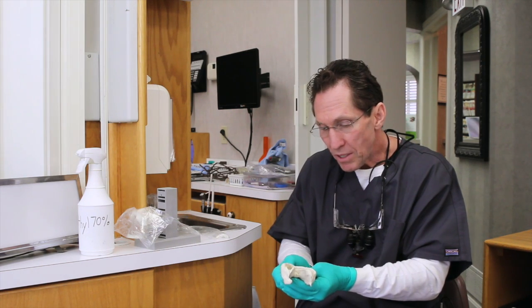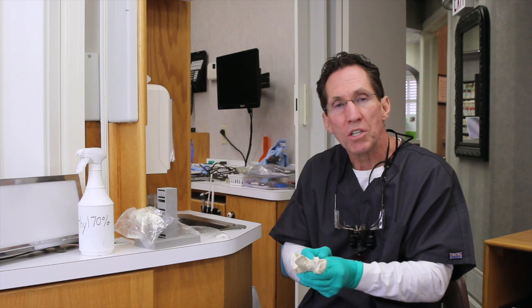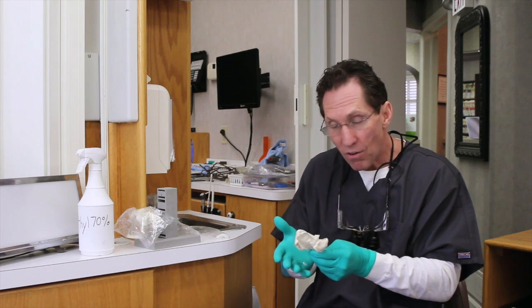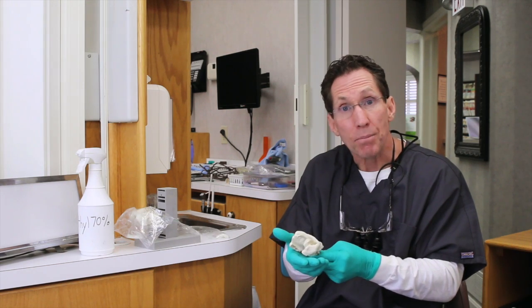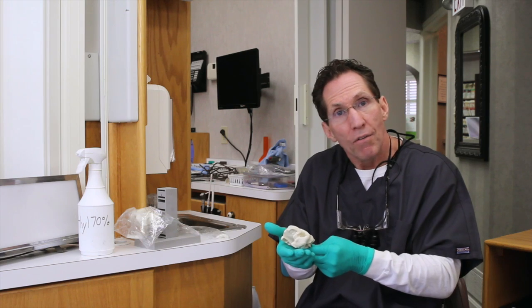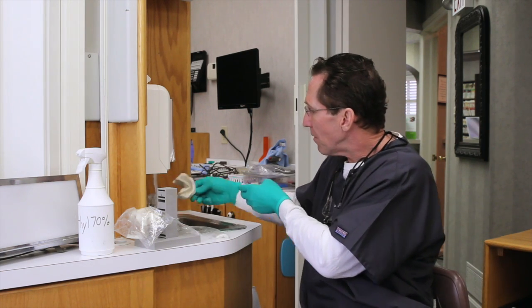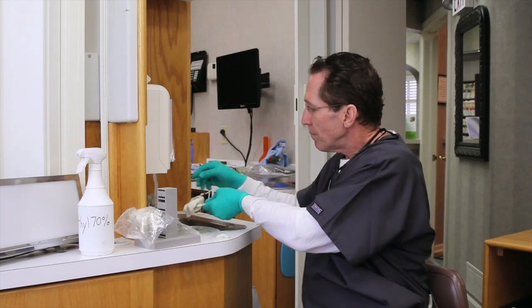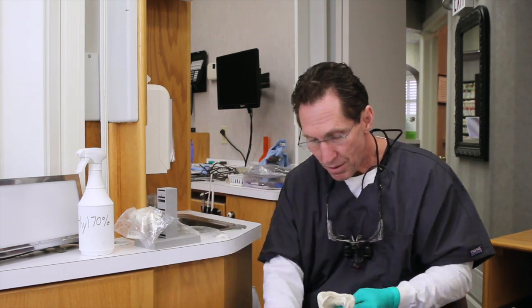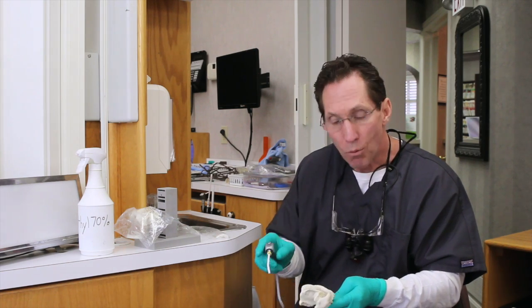And the first thing that comes into consideration is what are we going to do as far as moisture control? Because we understand that alginate is very able to absorb a lot of water. So first of all, we want to rinse the material off, any debris that might be on there. If you do the swishing that we described and showed, you really won't have debris, but if there is, we will rinse it off under the tap. And we'll kind of shake off the excess and blow off a little bit.